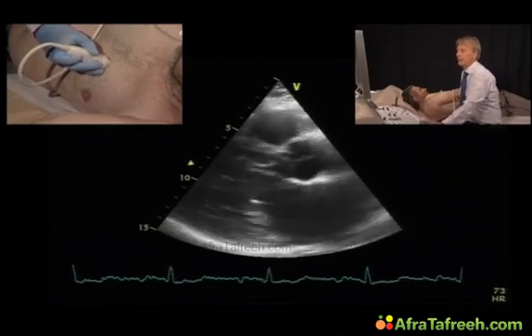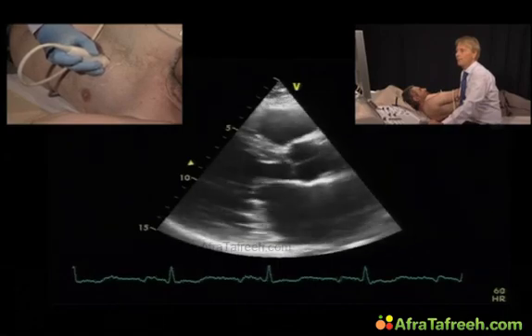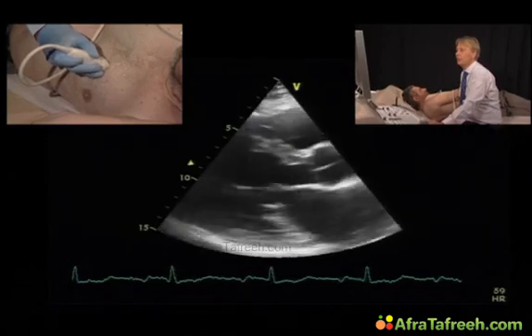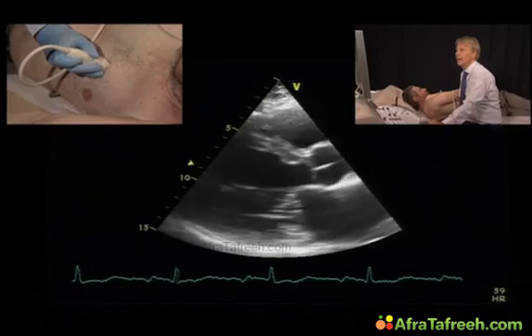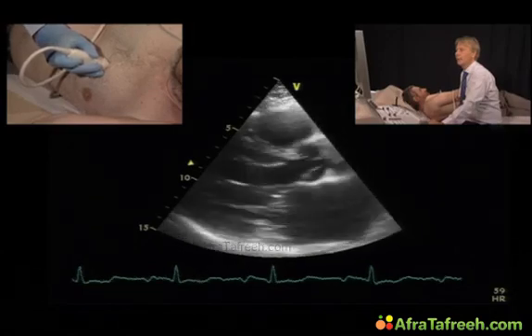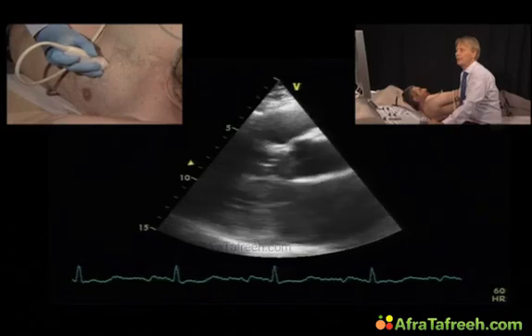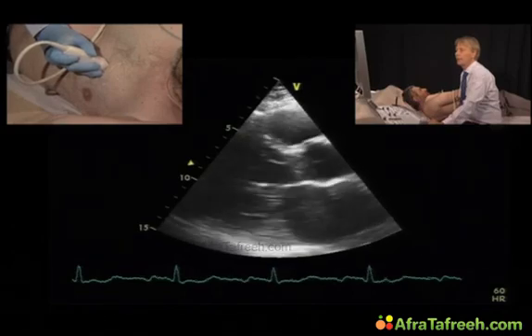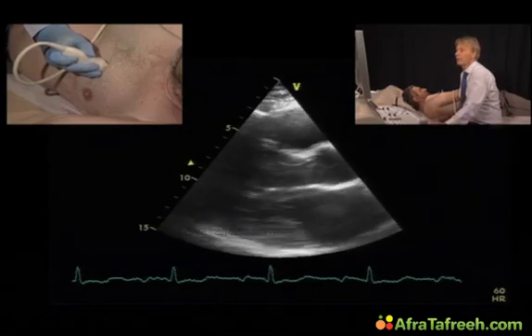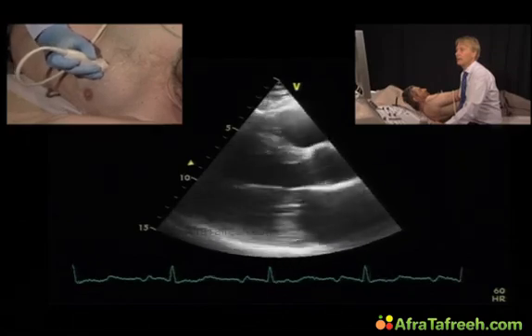This is the parasternal long axis view. And you can see that the patient has mitral valve prolapse, especially of the posterior leaflet, but we do not really see any portions of the valve which appear to be flail. But what you can do is you can tilt the transducer back and forth and try to find the region where the flail supposedly is. But again, I would not make the diagnosis from this view.